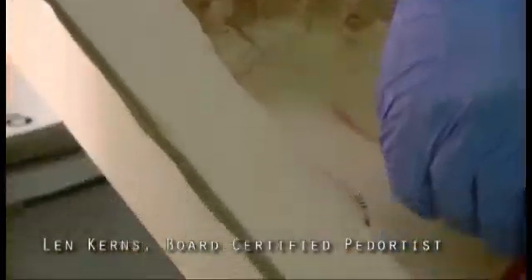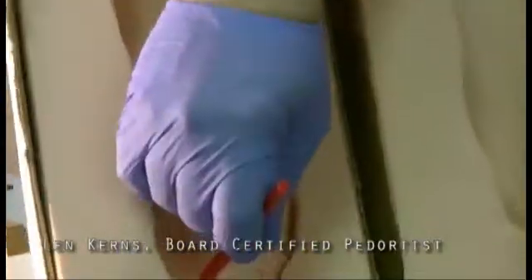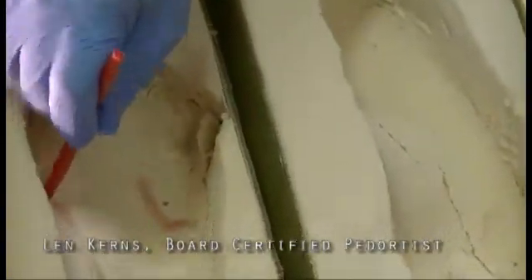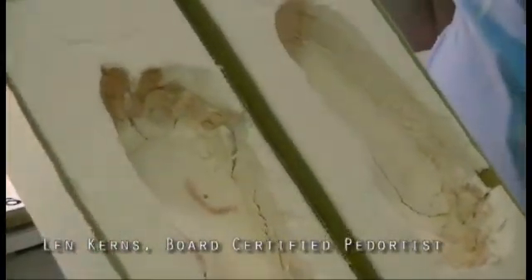You could also push your pen in the heel to the bottom of the box. And if you push it right here in the center of the fifth, it'll make the same size hole. But here it's going to make a bigger hole because the first metatarsal is coming up to 3-4 degrees. And this is how you make a proper cast.